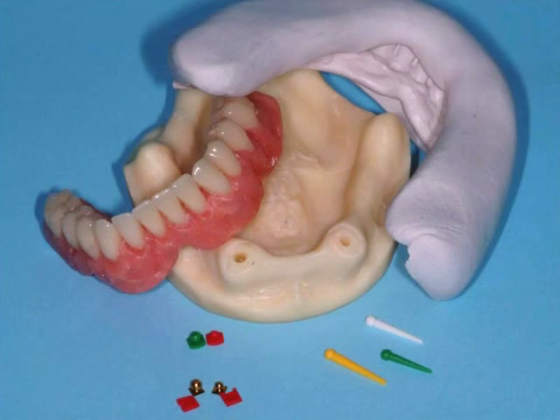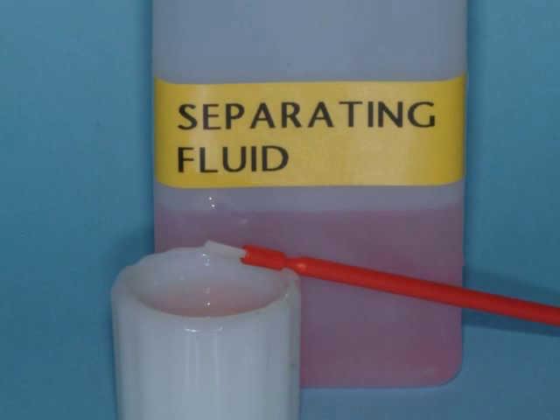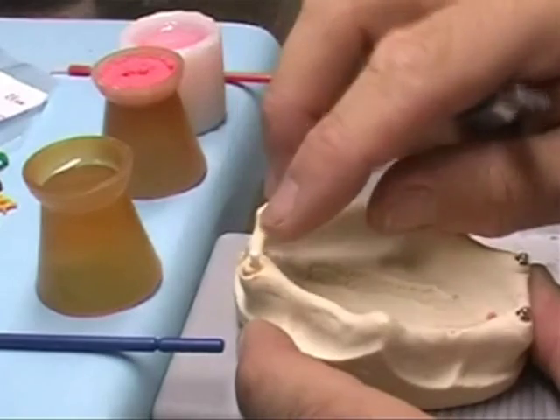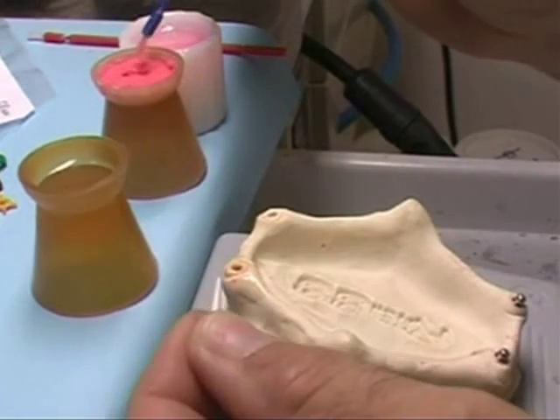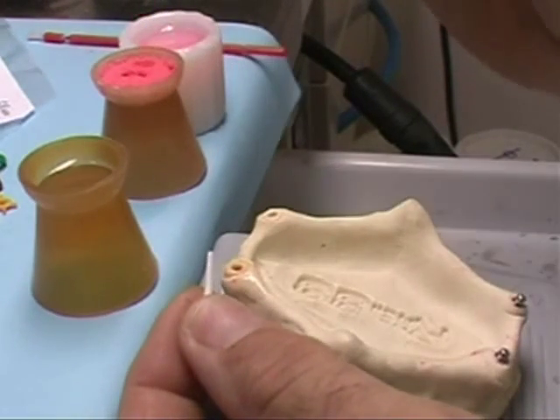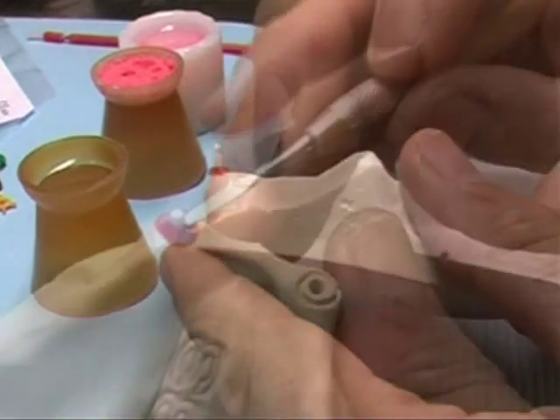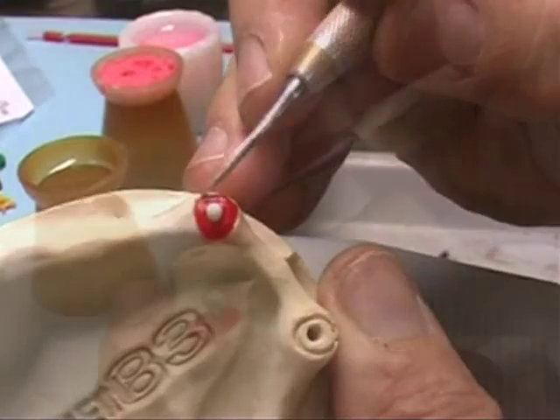To find the right position of the spheres and be able to set up teeth aesthetically, prepare a trial mask of the denture with waxed up teeth. If needed, it's possible to reline the castable post onto the root canal using self-curing resin or wax.